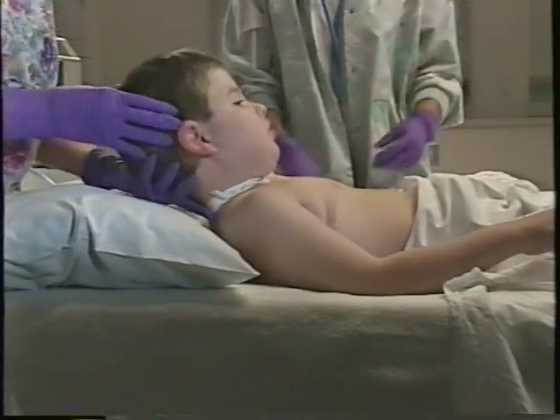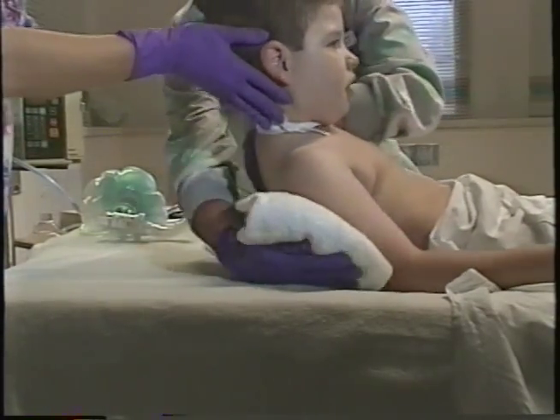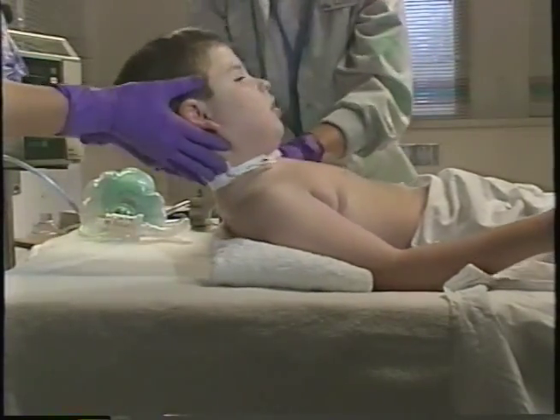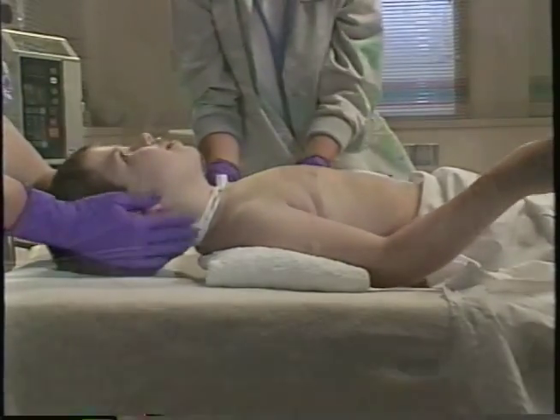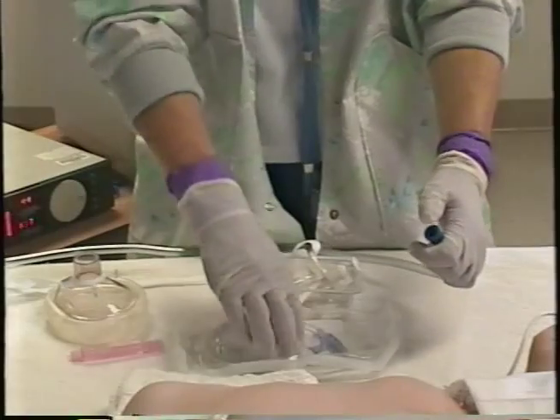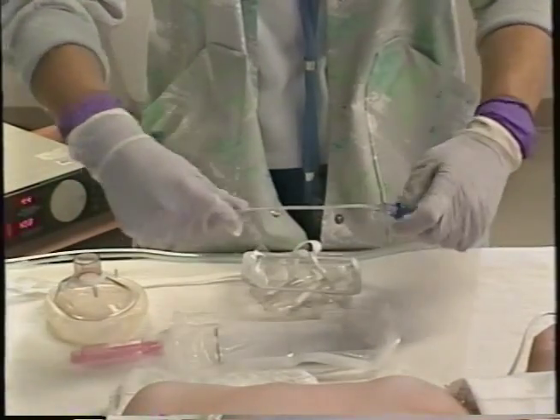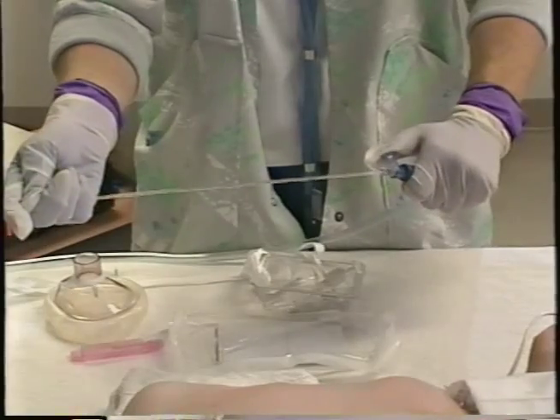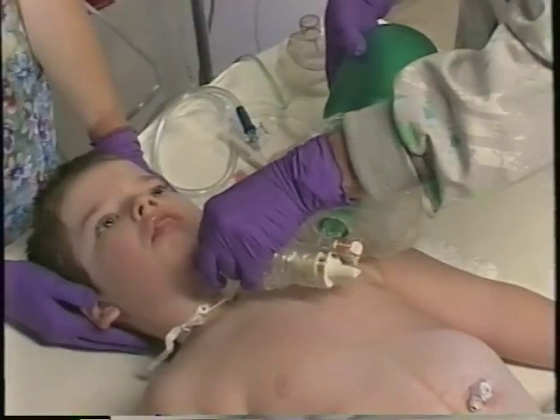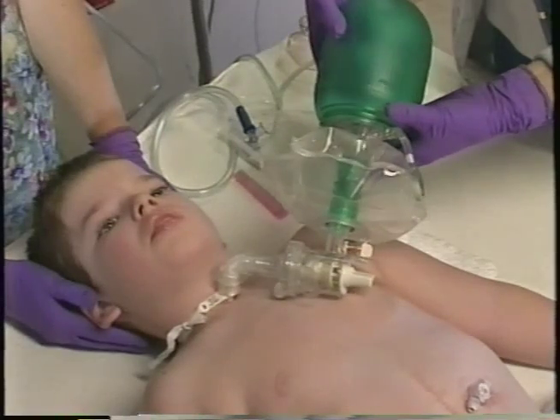To clear a suspected tracheal tube obstruction, first optimize patient position. Often a towel roll under the shoulders improves access to the neck and tracheostomy tube. Assemble and check your supplies. Prepare to suction and replace the tracheostomy tube. Next, provide manual ventilation with a bag valve device via the tracheostomy tube.